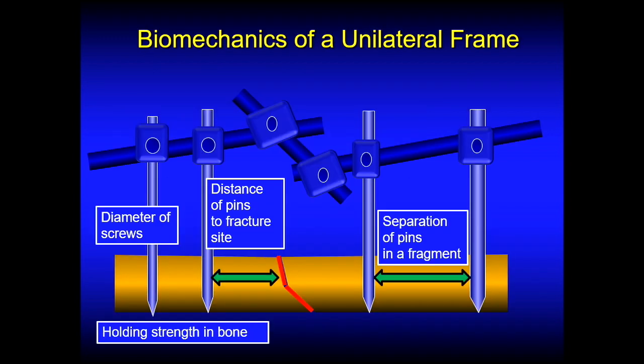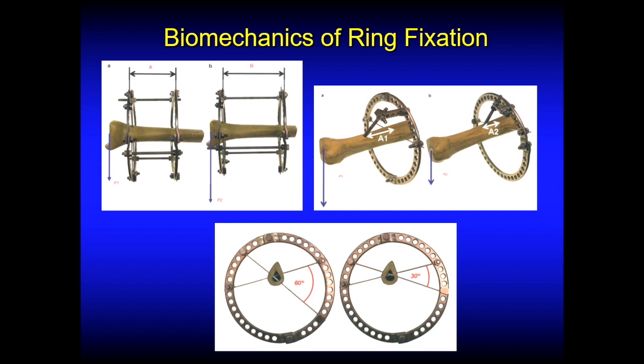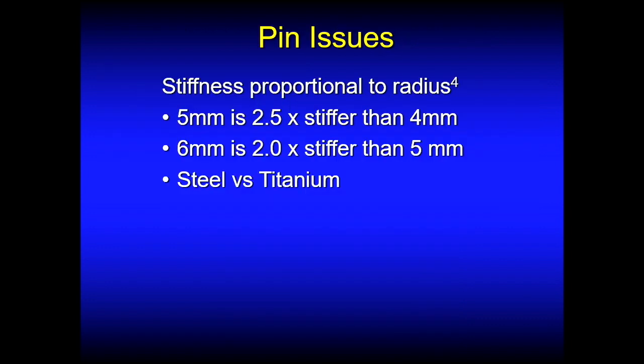I'm not going to go into this in great detail, but the biomechanics of unilateral and ring fixators drive how it responds in a given clinical situation, and the biomechanics that you achieve are up to how you put the frame together, how you choose the parts and how you apply them to the patient. Mechanics of unilateral fixation and ring fixation are the tools you're going to use. Pin issues are going to come up. External fixation involves pins going through the skin into the bone. Just remember that the stiffness of a pin is proportional to the fourth power of the radius. So a 5 millimeter pin is 2.5 times stiffer than a 4 millimeter pin, and a 6 millimeter pin is 2 times stiffer than a 5 millimeter pin.